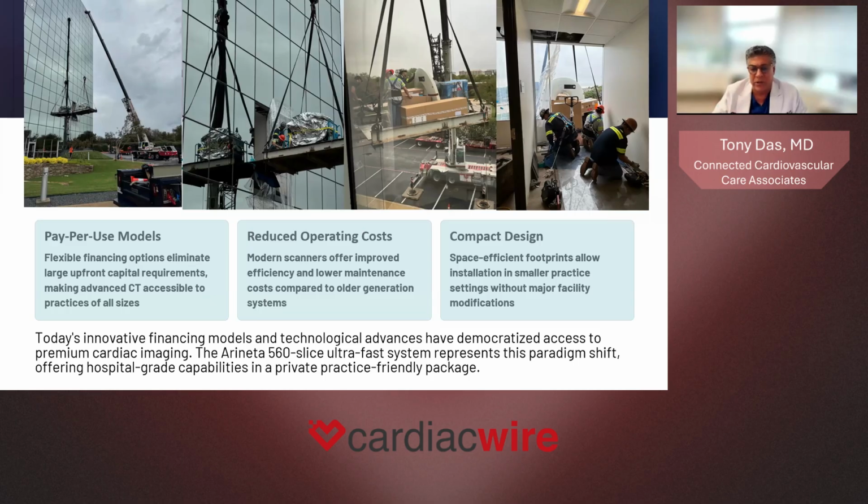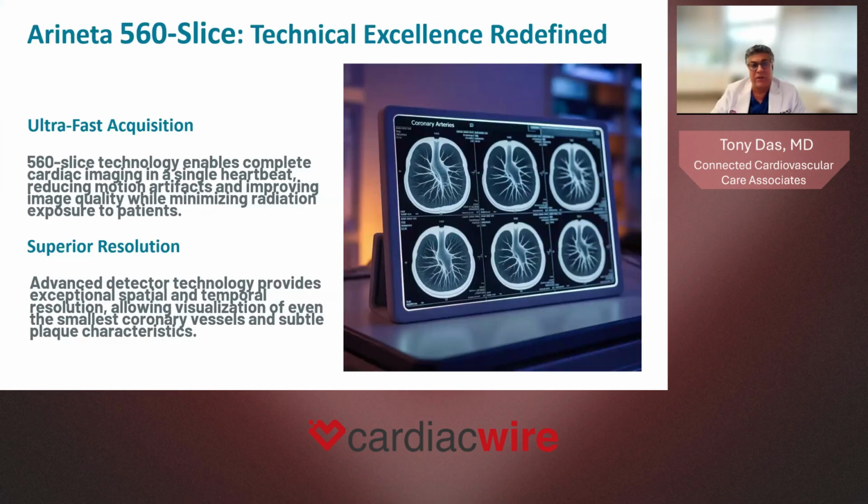So a couple of things changed to be able to give us access to this, sort of democratizing the concept of access to CT scanning, which is important also because at the time we got this scanner, the wait time to get a cardiac CT scan done in the hospital was at least 1 month, and in some hospitals was up to 2 months.